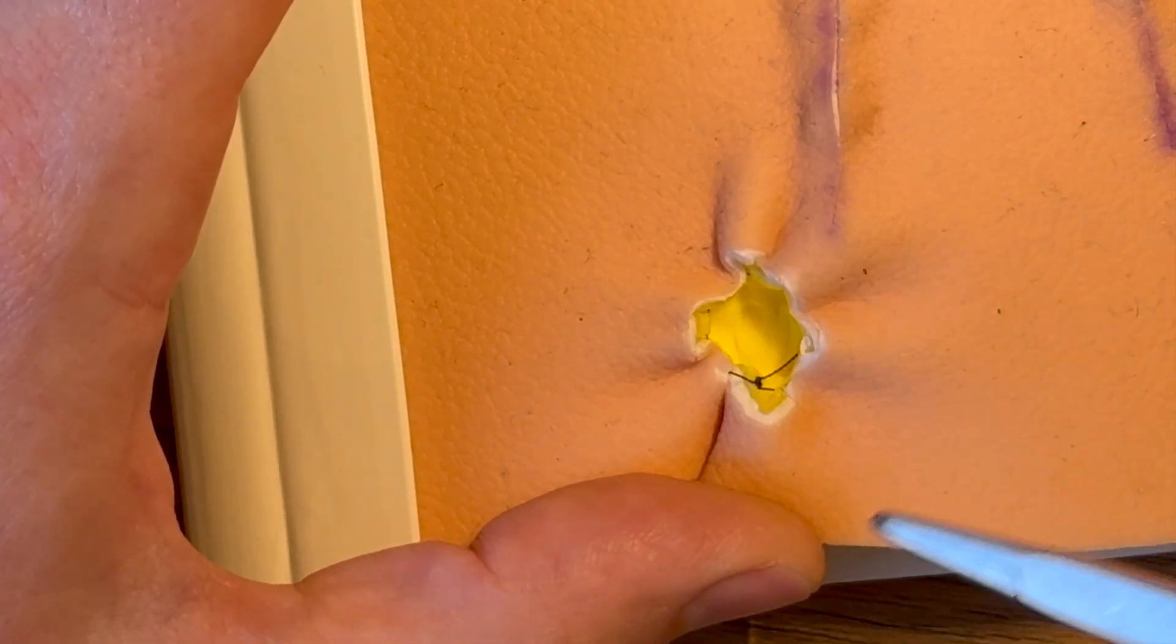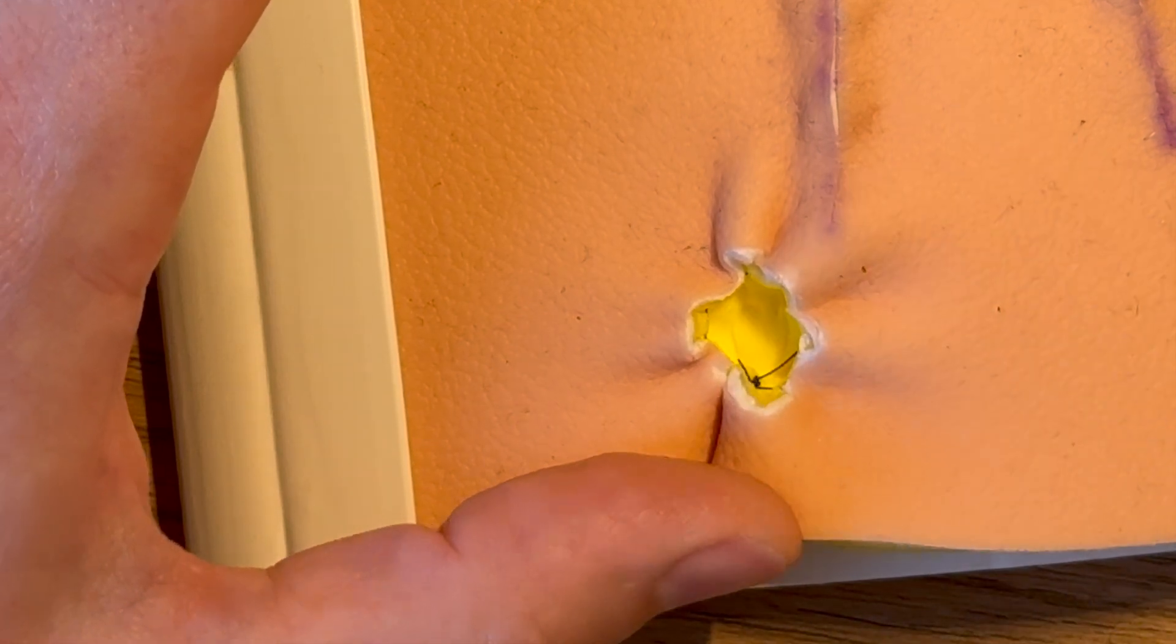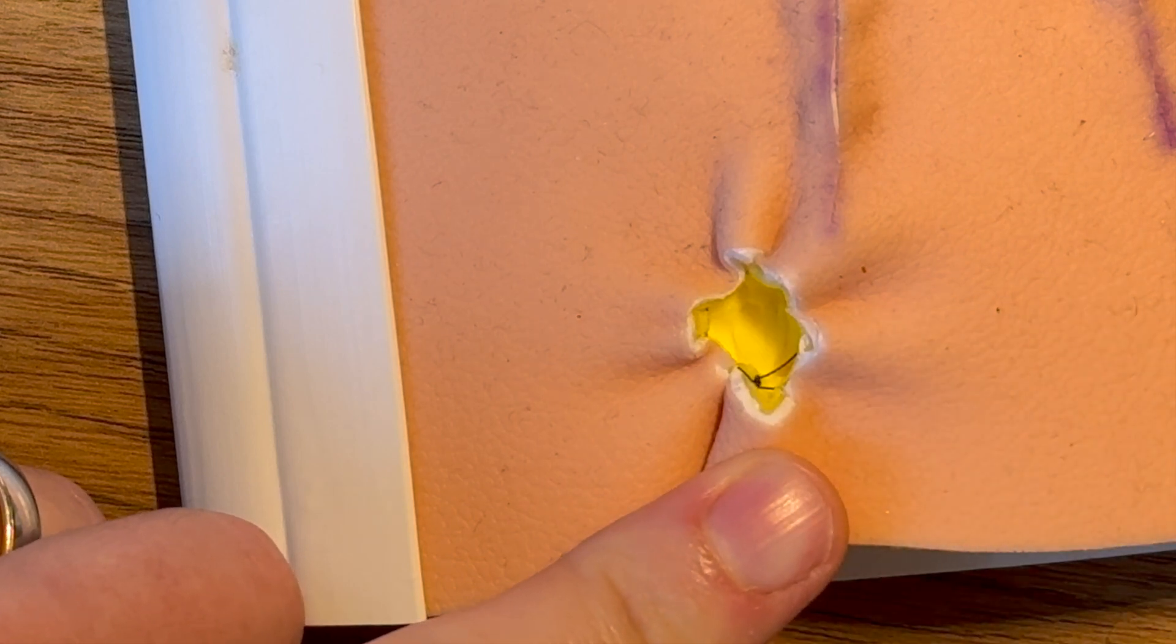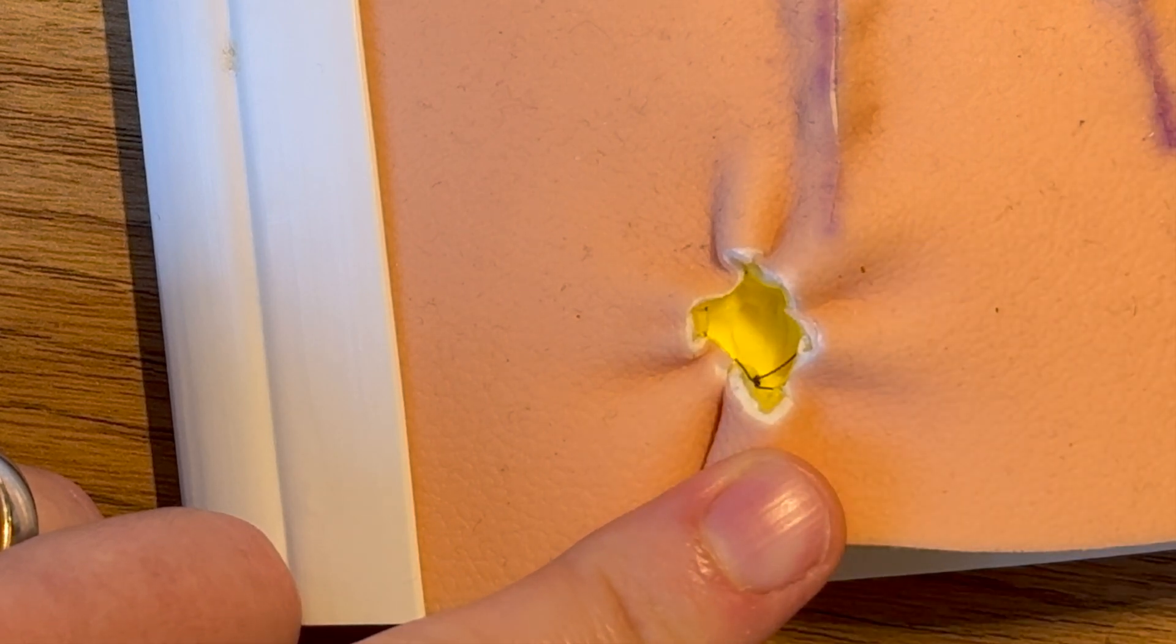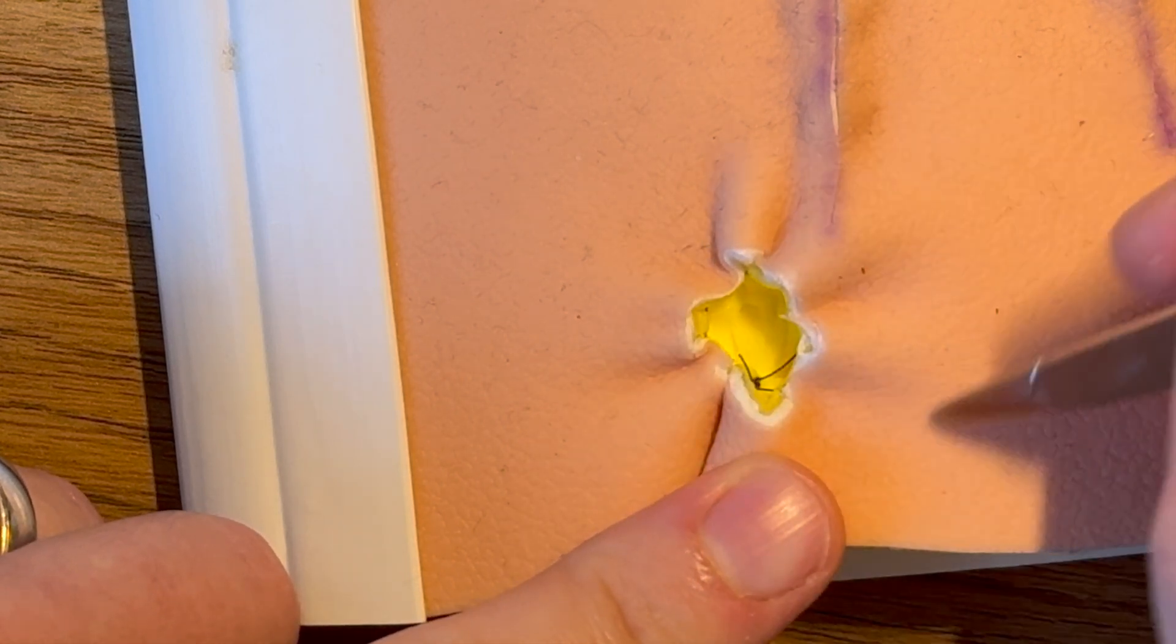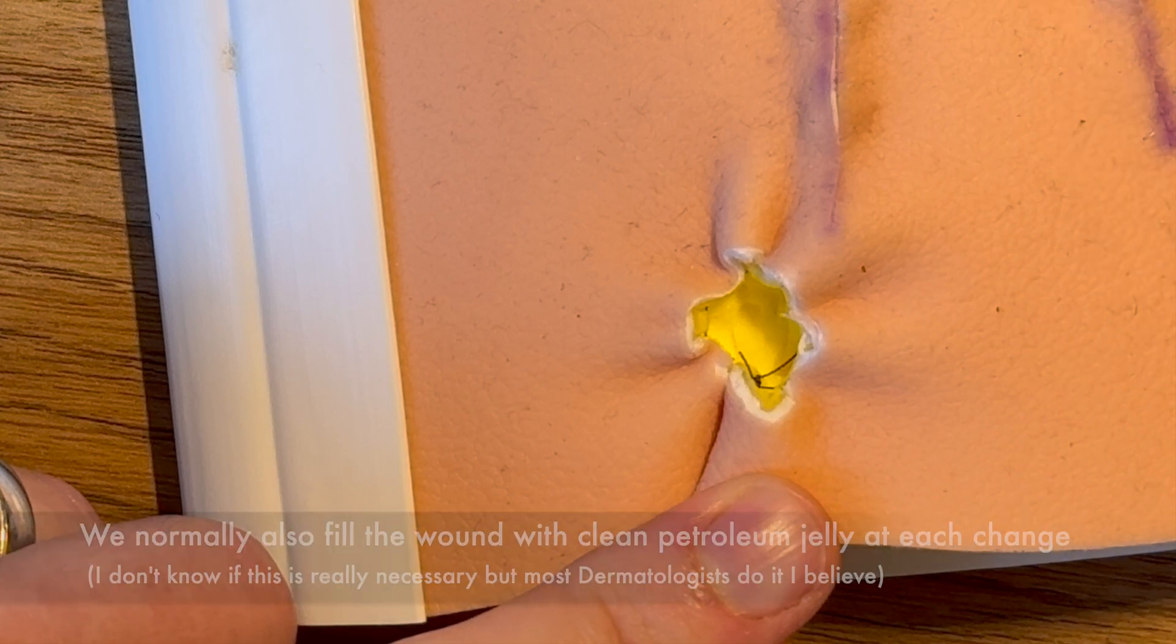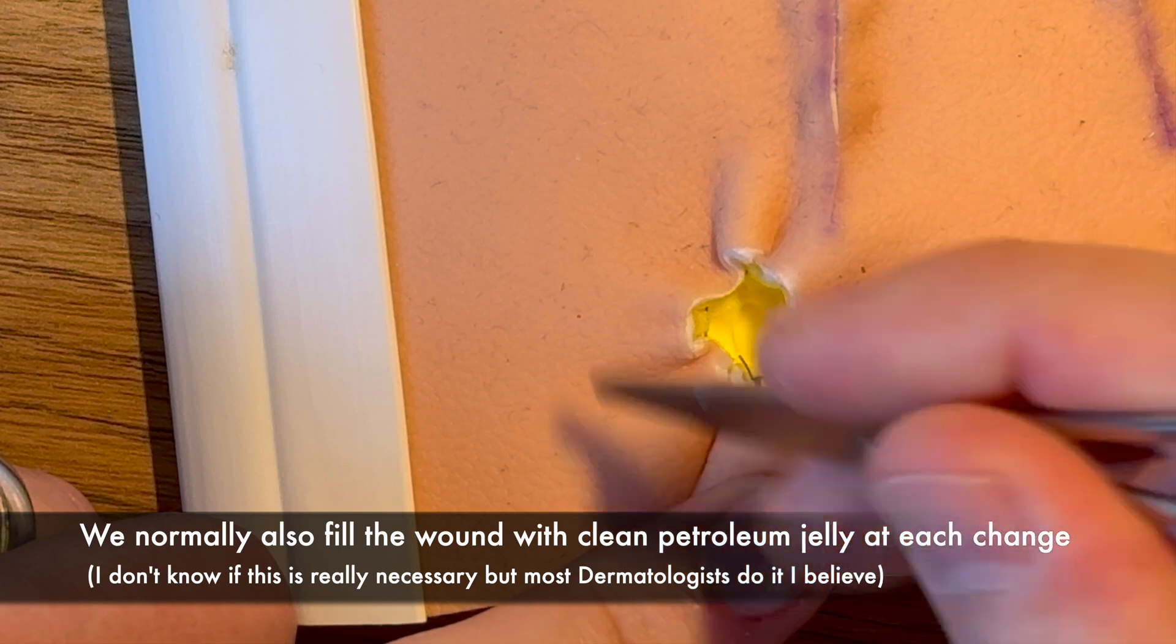And as far as dressings are concerned you'd usually put in an alginate dressing for a few days just while it's exuding in the first stage producing lots of slough. And then we change that to a hydrocolloid dressing and a patient could usually change that themselves at home every two or three days as it fills up and starts to detach.